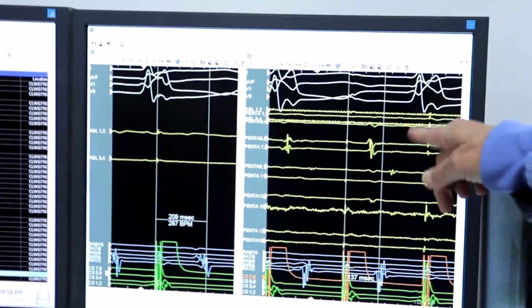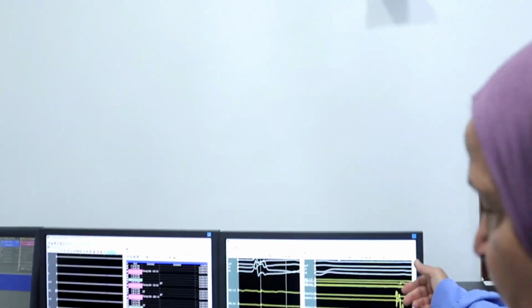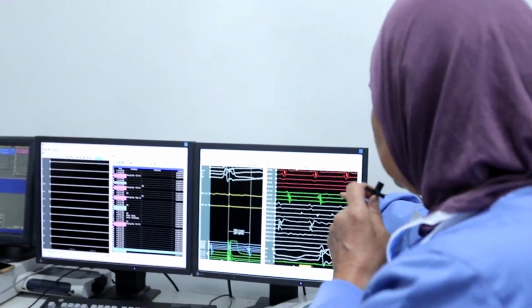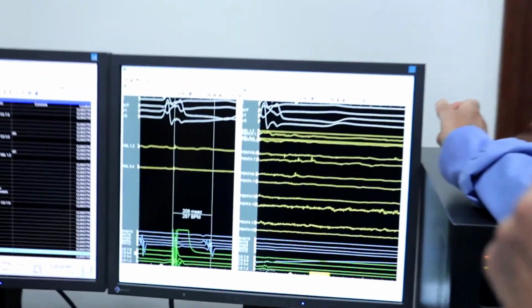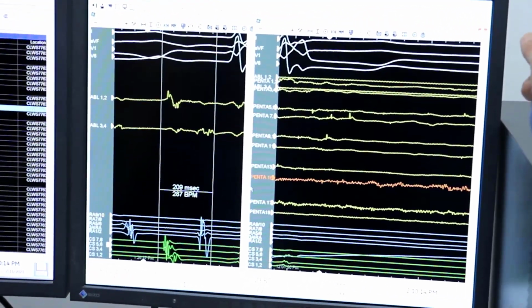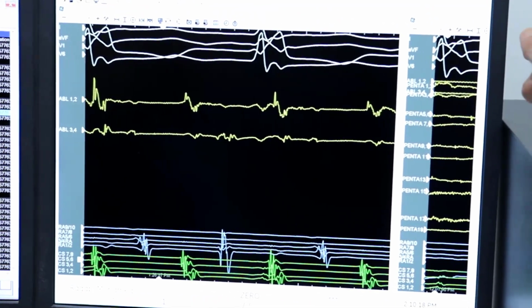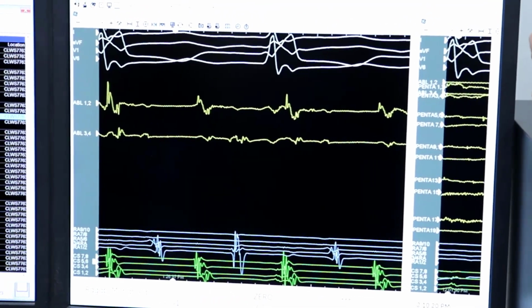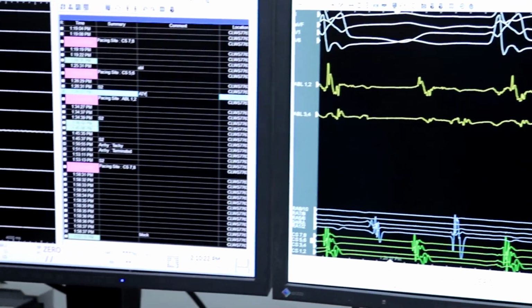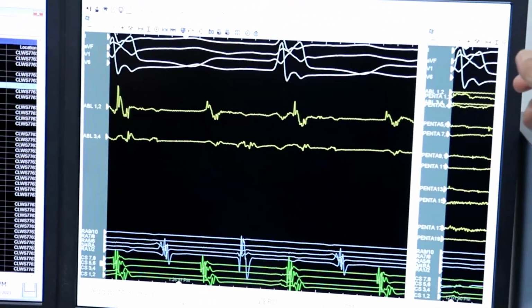So I would like to look at the atrial tachycardia, the one which was non-sustained. The PACs were scarce, so we did not pay any attention to it. This is the atrial. This one. This is the atrial 2 actually. Let's see if we can find the atrial.